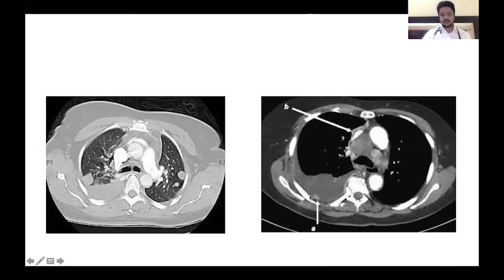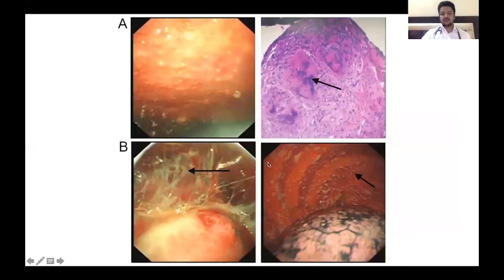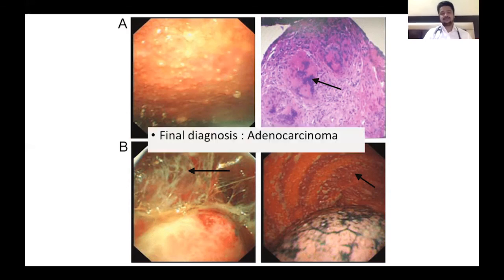Then we did thoracoscopy. In thoracoscopy, just like we introduce the chest tube, we introduce the thoracoscope, where we can see the pleura and the pleural nodularity. We take biopsy from these nodules, send them for histopathology, and can clinch the diagnosis. So thoracoscopy can be done when there is an effusion where, on tapping or diagnostic pleural fluid analysis, the diagnosis is not clear.